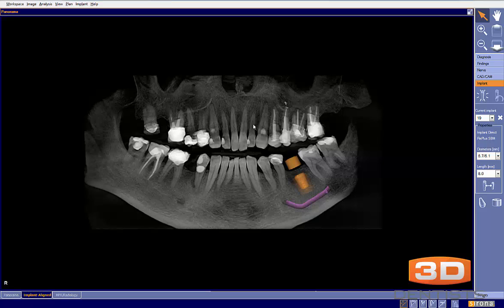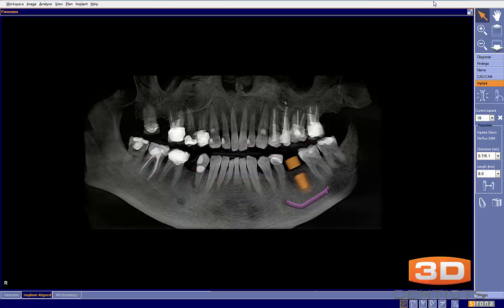I always like to start with digital versus analog. In this particular case, this is clearly a digital scan. We have plenty of natural teeth — not including this one, this one, this one, or this one — the rest we can use for integration of data. Since we need two points for integration, we're totally good. So this is a good case for a digital workflow, which would be either the OptiGuide, DigiGuide, or SerGuide2.